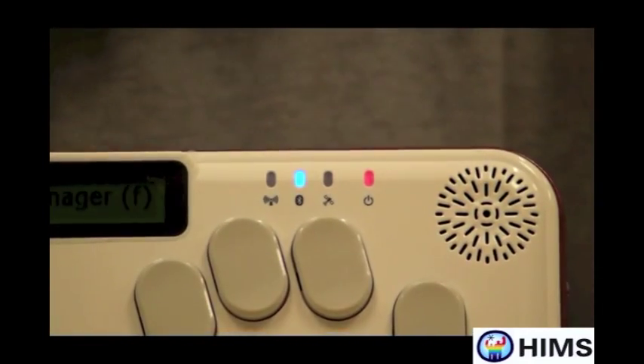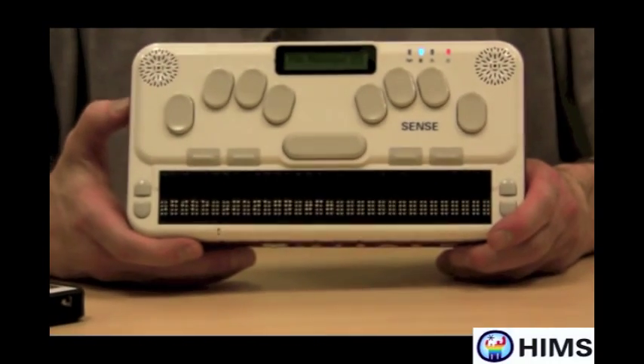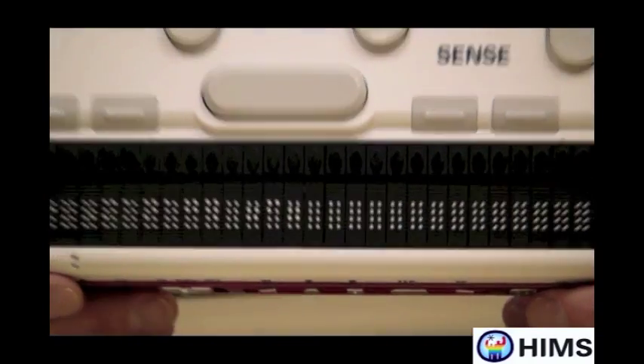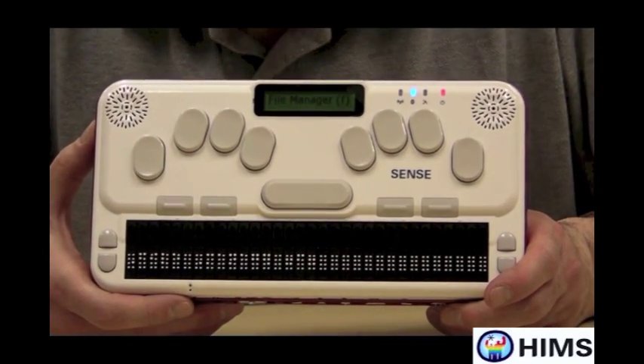It's also the wonderful note taker device that hopefully you have grown to love in the past. It has 32 cells of Braille, it has a full keyboard, and it has many, many other features such as internet browsing and email access.